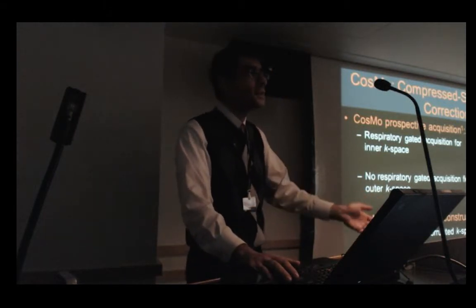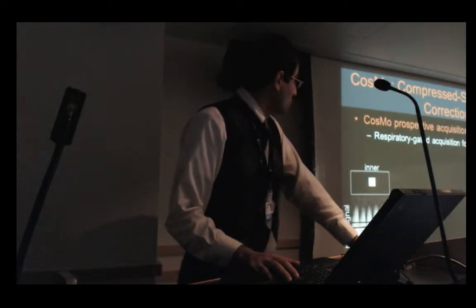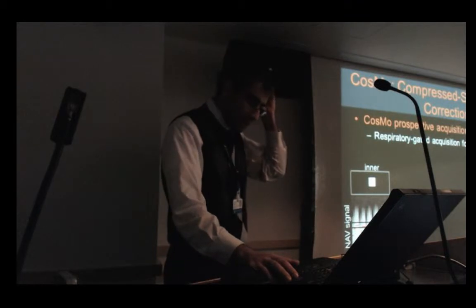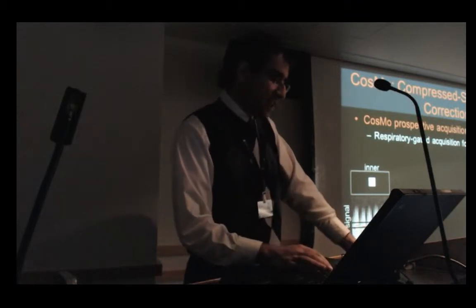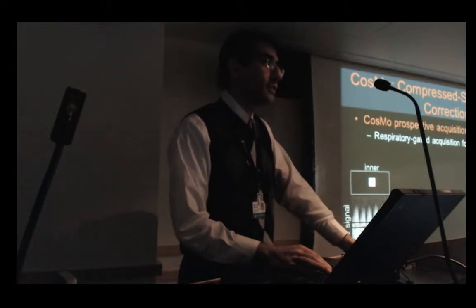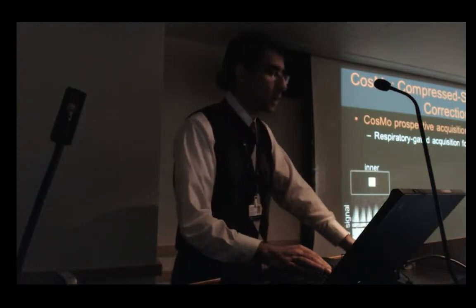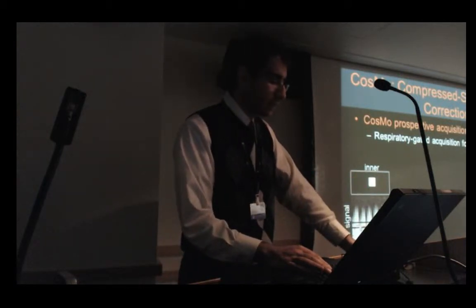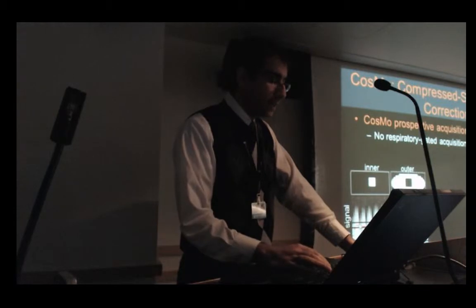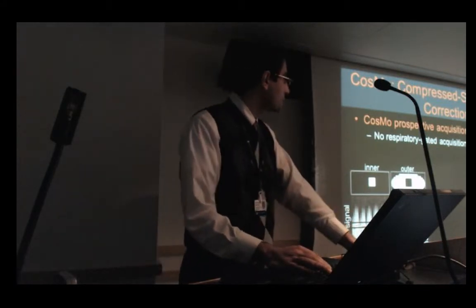Then I'm going to acquire some of the data which are corrupted with motion. I have shown those in the red line. Retrospectively, when the scan is done, we're going to go and select the data that are motion corrupted. We replace them with zero, and we use the compressed sensing to detect those motion corrupted segments and to generate the final image. In that case, definitely I'm not prolonging the scan time twice. I'm finishing the scan at the right time.